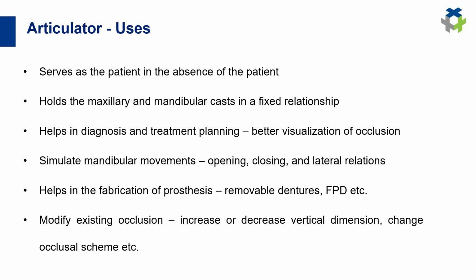And when we go for a complete change of occlusion, where we want to modify the existing occlusion, like increase or decrease the vertical dimension or change the biting pattern, which is called the occlusal scheme of the patient, we use the articulator.